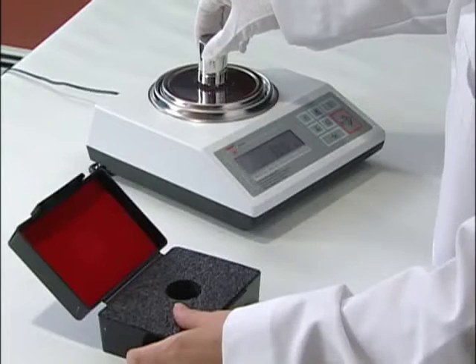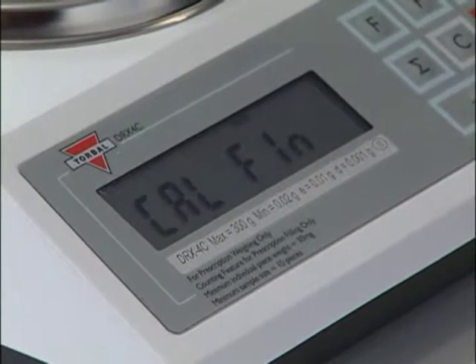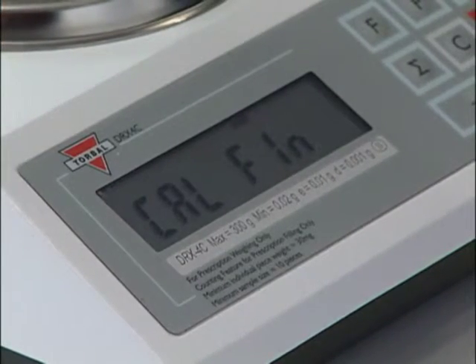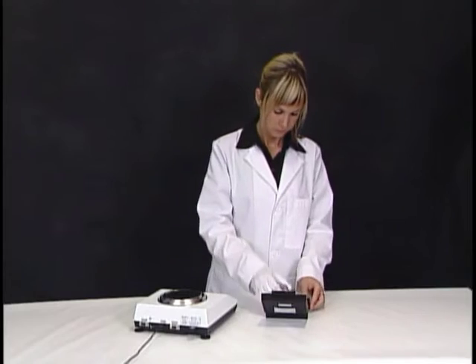Simply place the calibration weight on the pan and wait for the calibration process to finish. Once the scale indicates calibration is completed, toggle the rear calibration switch to the original position and remove the weight from the pan.